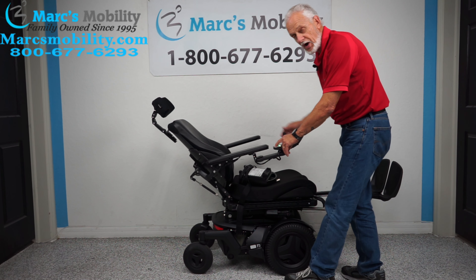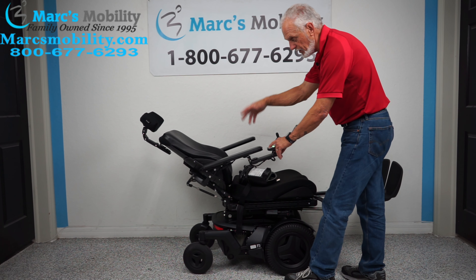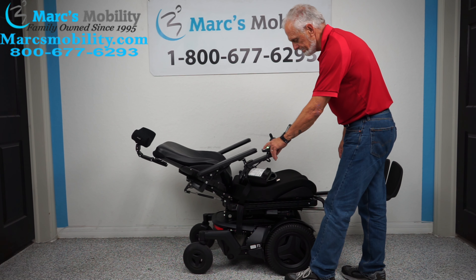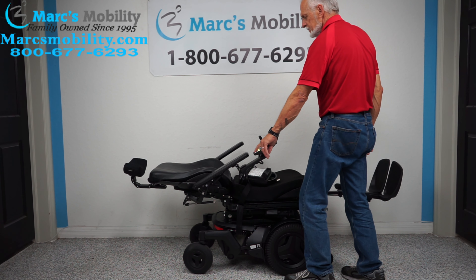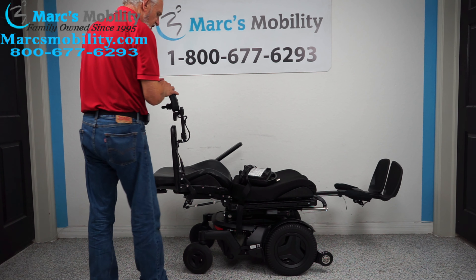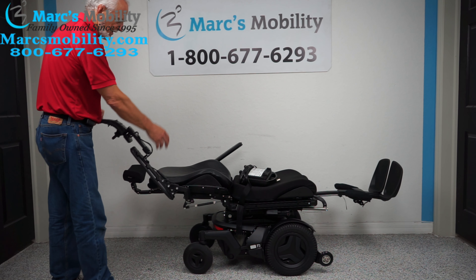I just want to show you how far back it's going to go. If you wanted to relax and go all the way back, it's pretty much flat all the way down. These arms can be flipped up, so if you transfer from the side, they go all the way up — both sides.